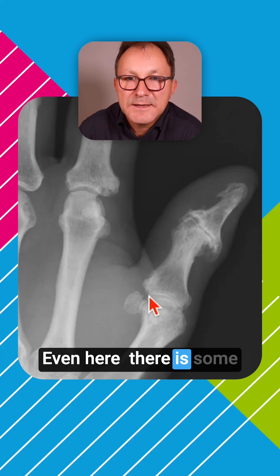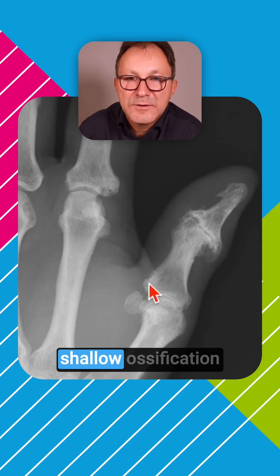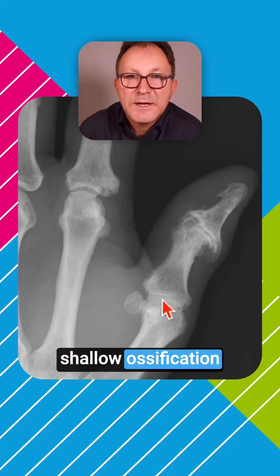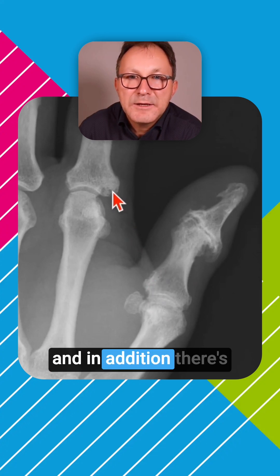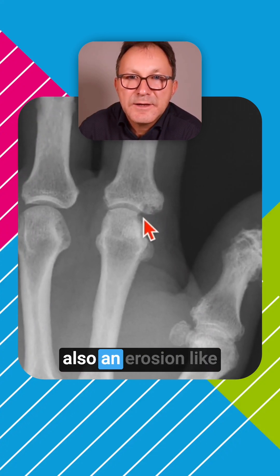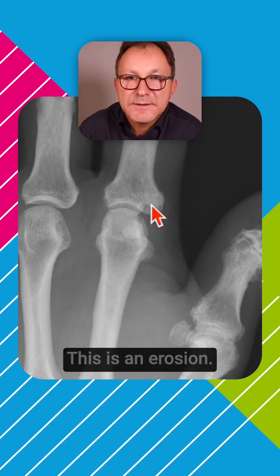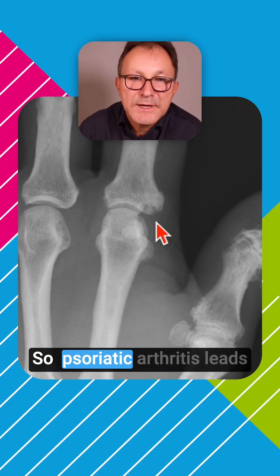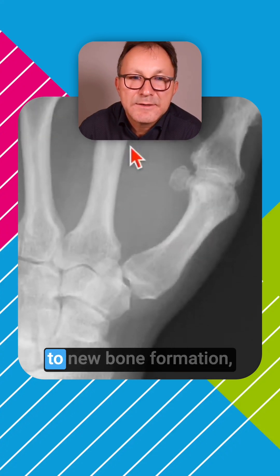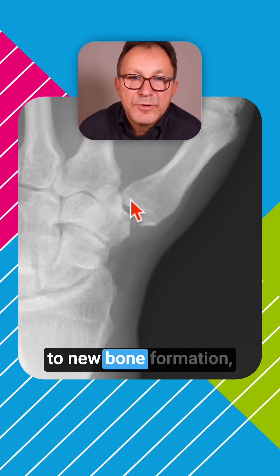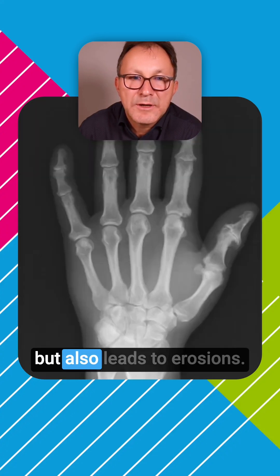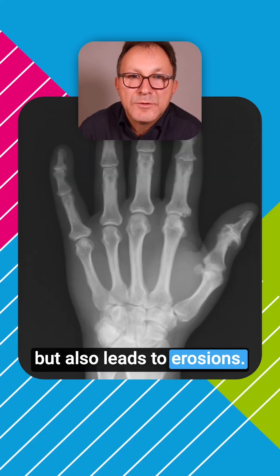Even here there is some shallow ossification. In addition, there is also an erosion — as in our second case, this is an erosion. So psoriatic arthritis leads to new bone formation, but also leads to erosions.